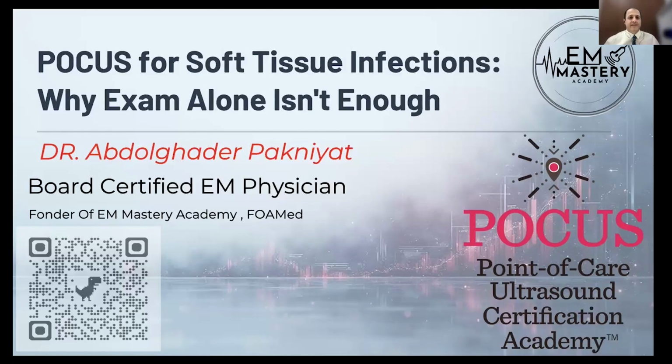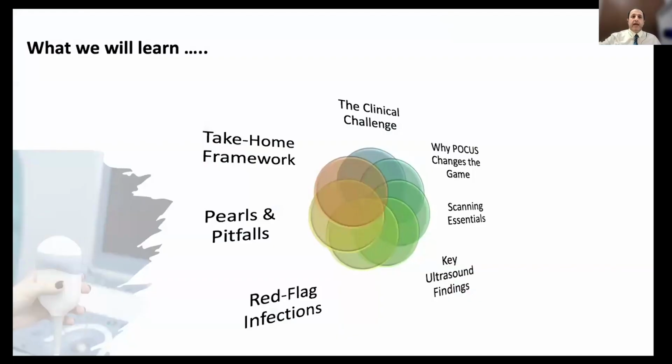That's why we need to add some extra ability like POCUS, to go through the body and see what's happening under the skin.